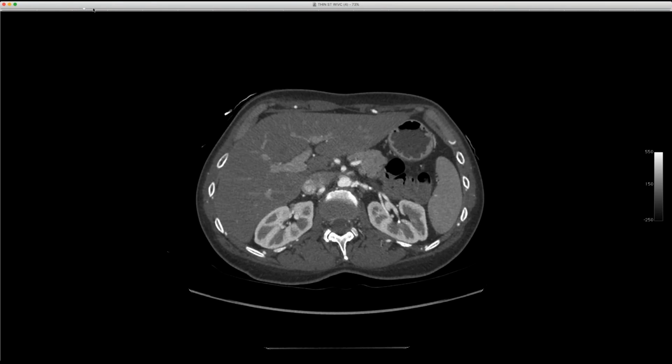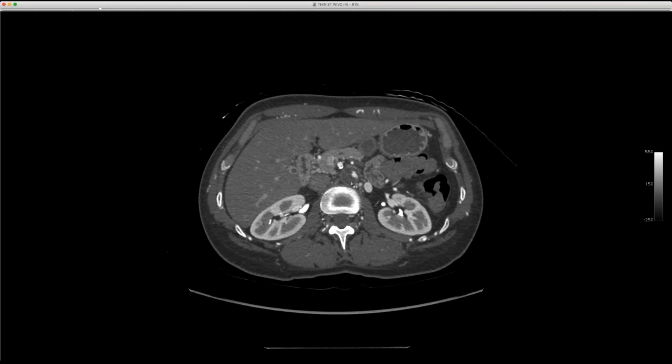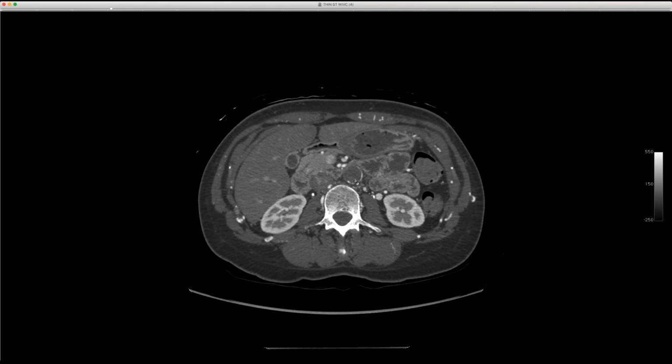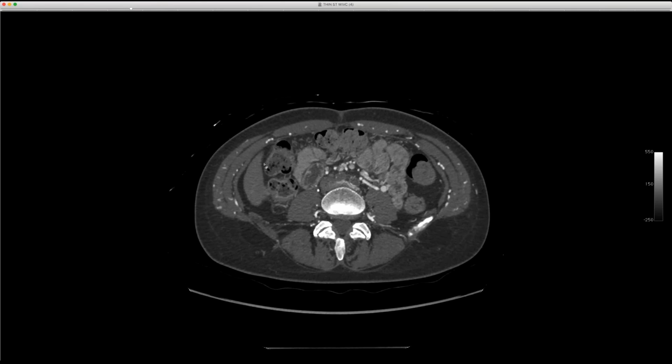Thank you. So watch the aorta go down. As we go down, you can see that it's got a very small lumen, and here there's hardly any contrast, and there it's occluded. So this is a Leriche syndrome, but this is a beautiful case because you'll notice all these collaterals in the body wall. And as I go down, you can see them all.